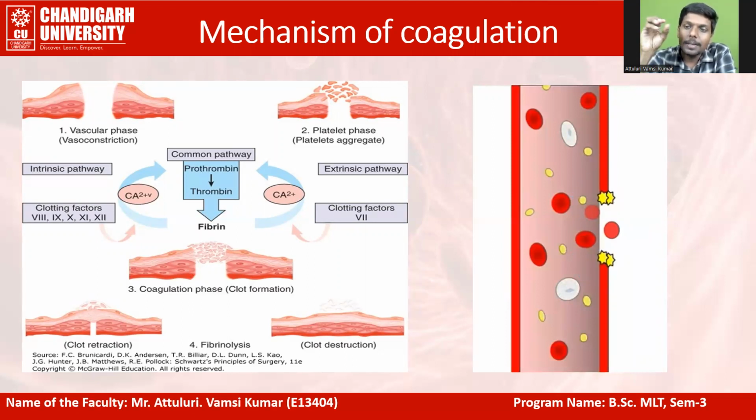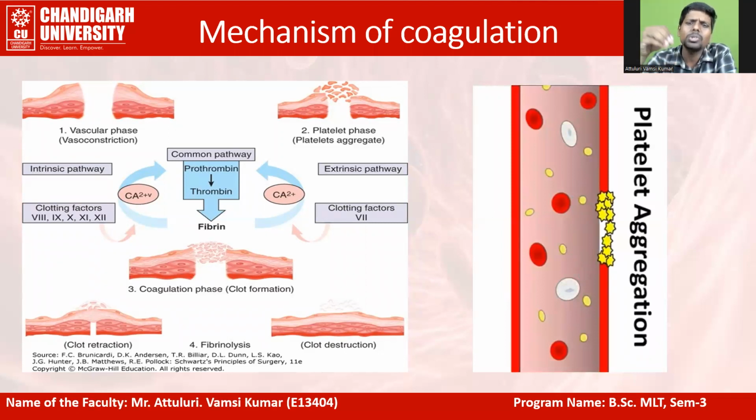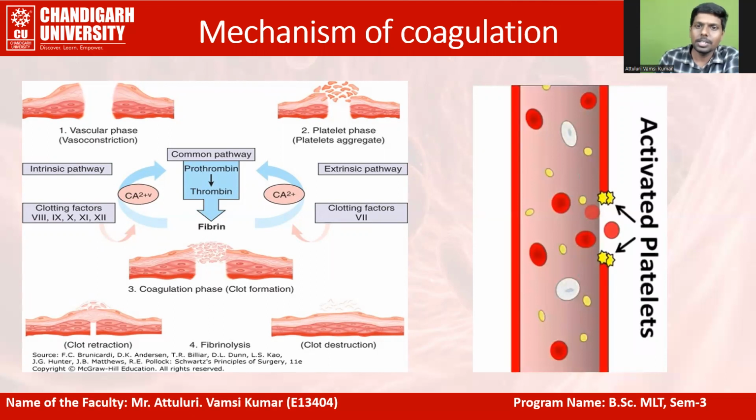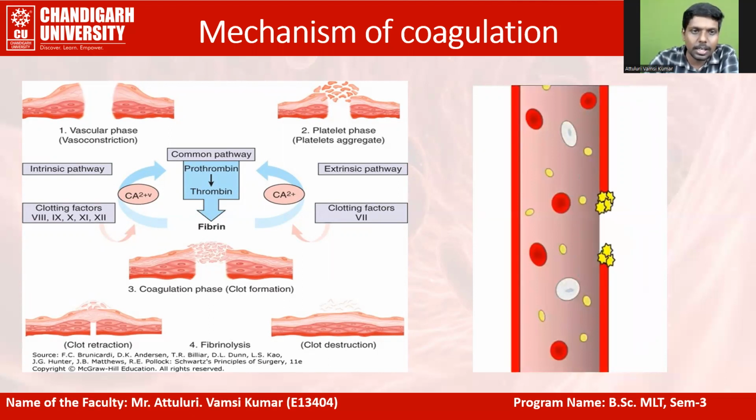And this mechanism is called chelation. Chelation is the process of removing calcium from the blood. Most of the anticoagulants will remove calcium, such as EDTA, ethylenediaminetetraacetic acid, which is a chelating agent. It will remove the calcium from the blood, resulting in prevention of clotting, or keeping the blood in the liquid state. This is all about anticoagulants and their basic understanding.